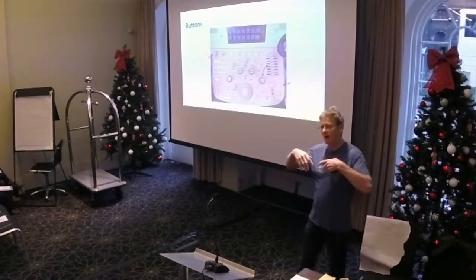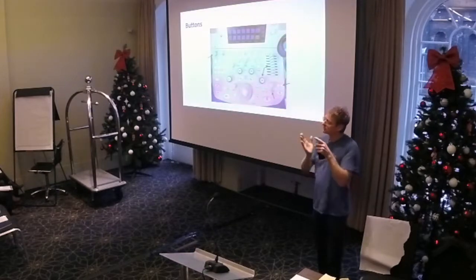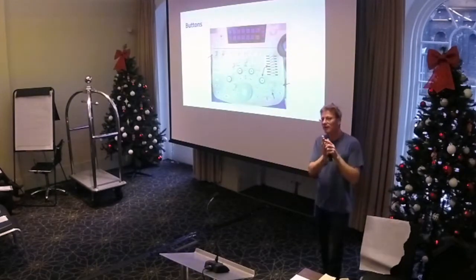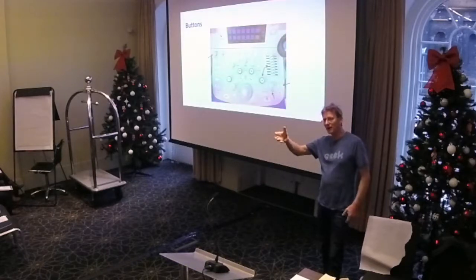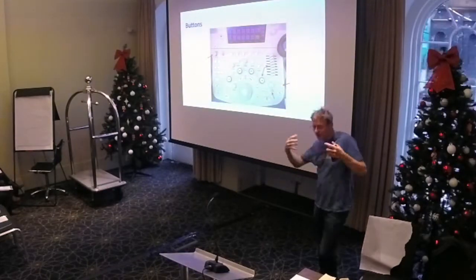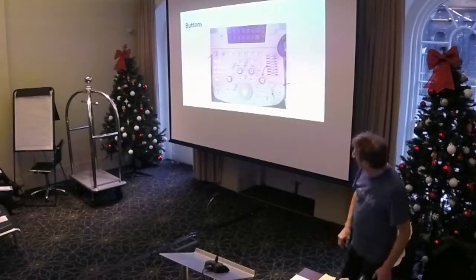So you need to understand and adjust the persistence and understand what's going on, so that if you're looking at something very fast, which is why you should use a cardiac setting for looking at hearts, then it cuts down the number of sweeps before it produces a frame, which then gives you a slightly less good quality picture, but it's better for fast moving stuff. So my favourite phrase is, make sense? Does that make sense?